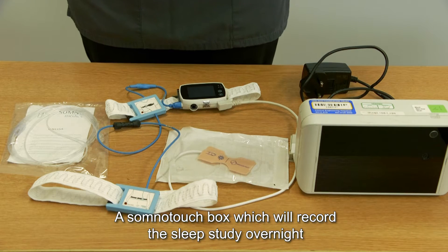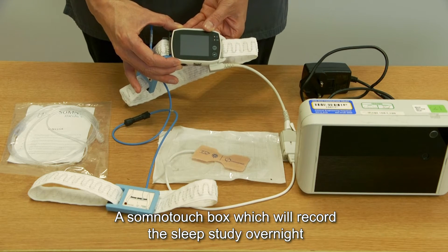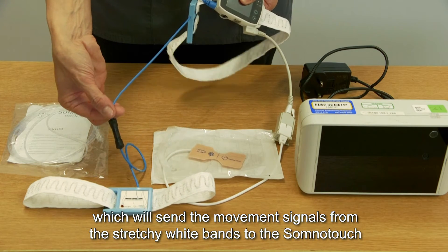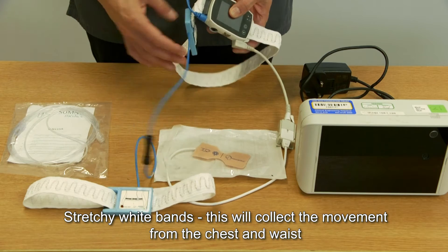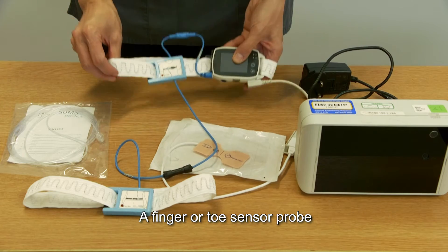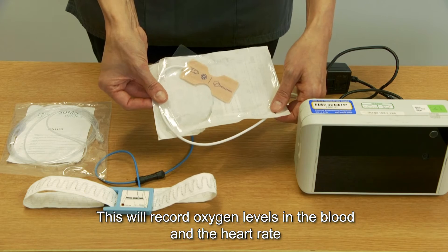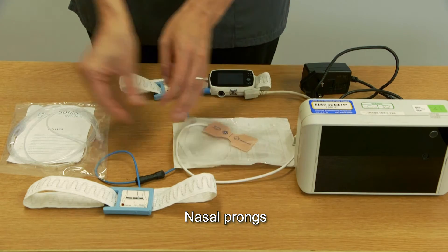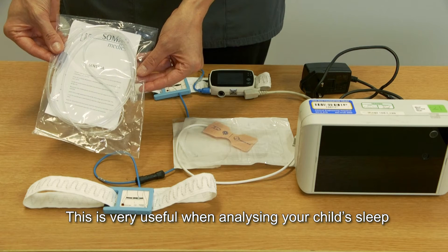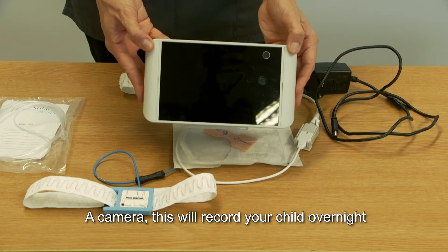This box will include: a SomnoTouch box, which will record the sleep study overnight; a blue band connector, which will send the movement signals from the stretchy white bands to the SomnoTouch; stretchy white bands, which collect movement from the chest and waist; a finger or toe sensor probe, which records oxygen levels in the blood and heart rate; nasal prongs, which help look at breathing and snoring; and a camera, which will record your child overnight.